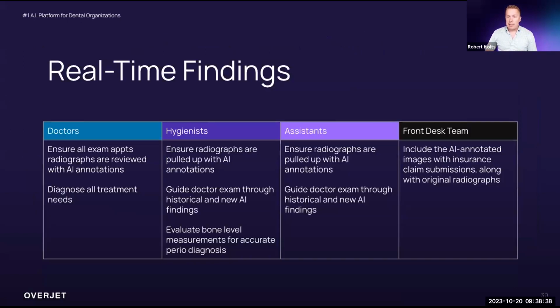So real-time findings, I'll just touch on real briefly. Real-time findings, again, when you think of AI in dentistry, this is what you're thinking of. I've got annotations, I've got caries and calculus and bone loss, and I'm going to draw it on an x-ray. Okay, it is a super impactful thing to do. It's got a lot of impact in helping us diagnose more accurately.